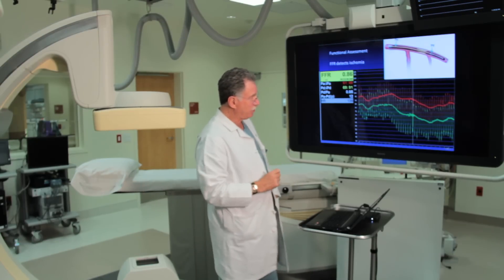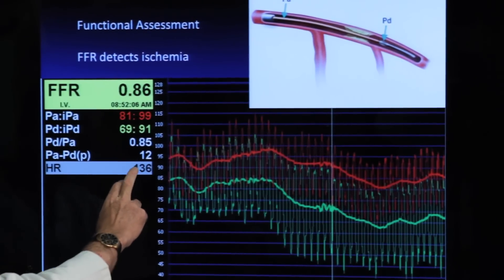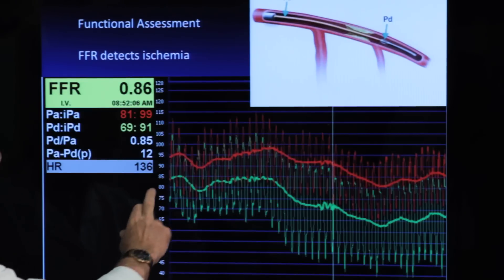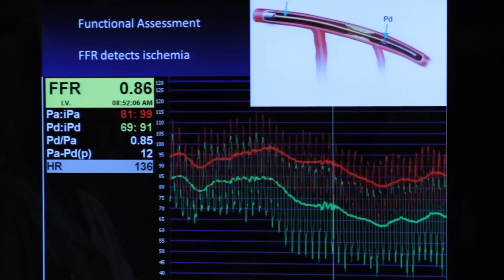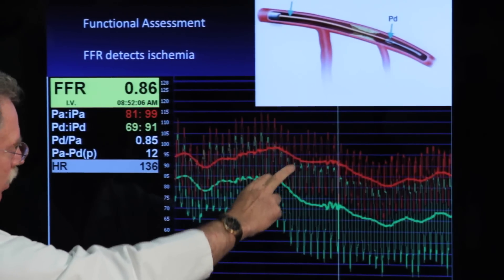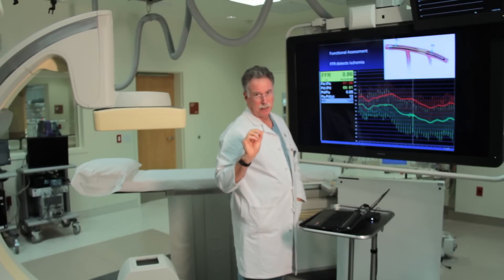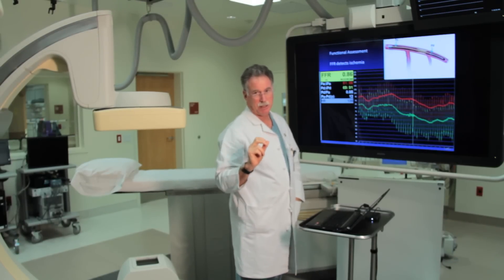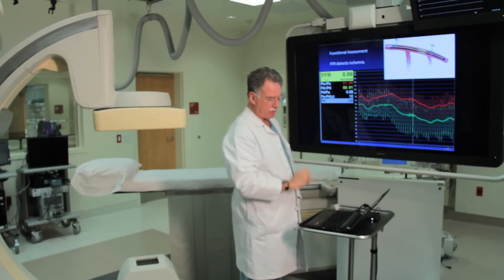Here's a cartoon of the pressure wire beyond the stenosis. Here's a display of the aortic pressure in red and the coronary pressure in green. At maximal hyperemia, at the initiation of the hyperemic period, we can acquire our ratio of distal pressure to aortic pressure and produce our FFR number. We know that this number is an in-lab, artery-specific measurement of the ischemic potential, which is equal to what we would get if we did a stress test on this one artery.